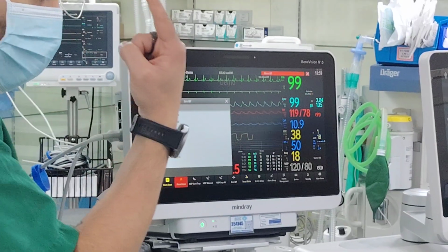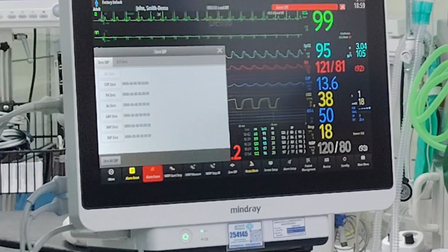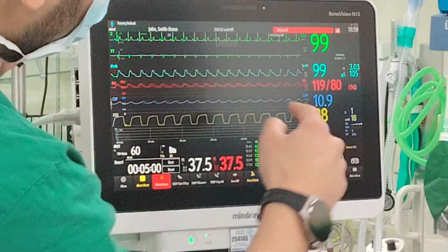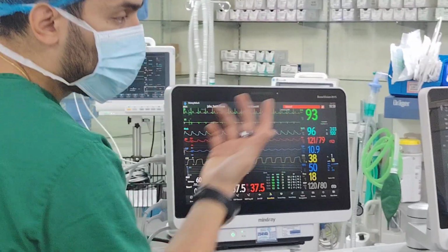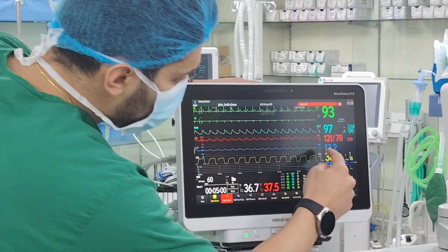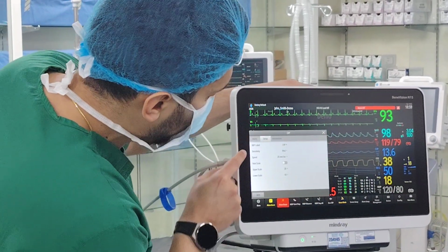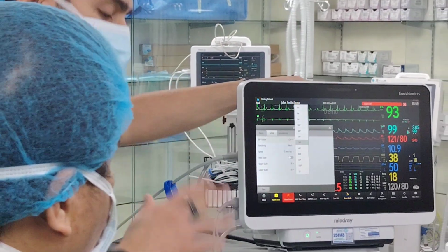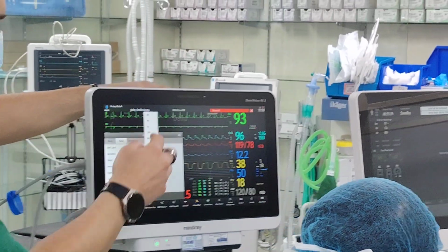What if you want to do only one? You press this. It will do the zeroing. You're good to go. Okay? Is it clear? Now, let's say today, this was PA, pulmonary artery pressure, PAP, not CVP. Because the measurement is very close, right? What you do is you click here, set up, very good doctor, exactly. See label, click here, change to whatever label it is. Because the measurement pressure is actual pressure. Labeling, you just have to label it and that's it.